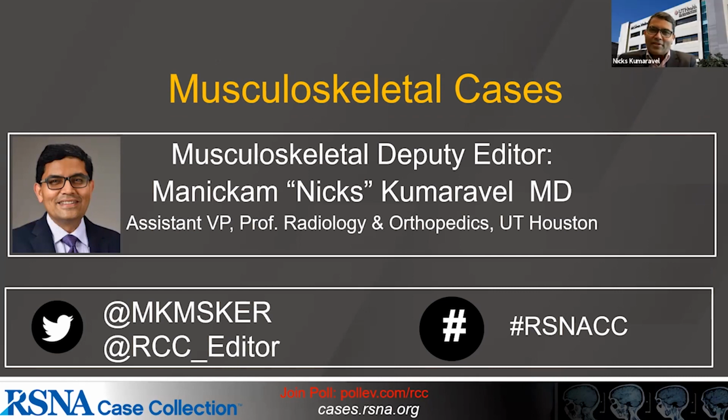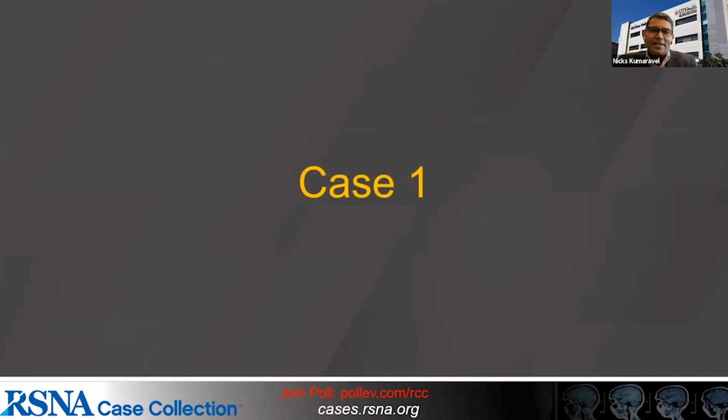Thank you very much, Sophie. And welcome to the case collection to everybody. We're going to start off with a couple of cases on the musculoskeletal side. The intention is to get you to think about these cases as we go through, and imagine that you're going through this case in your reporting file. What would be interesting to you, and how do we go about this? Let's go to the next slide.